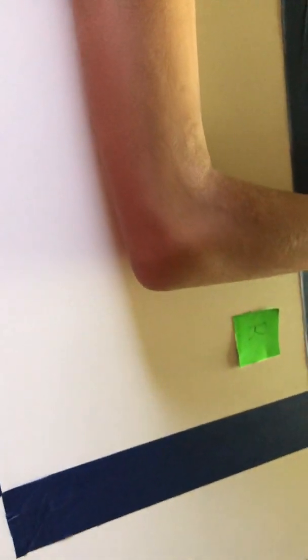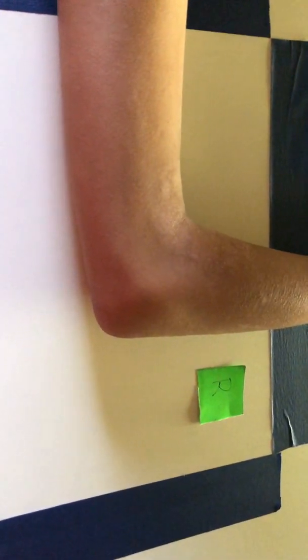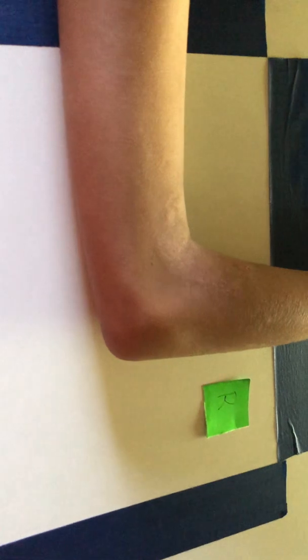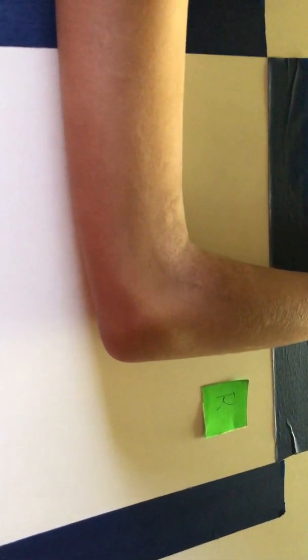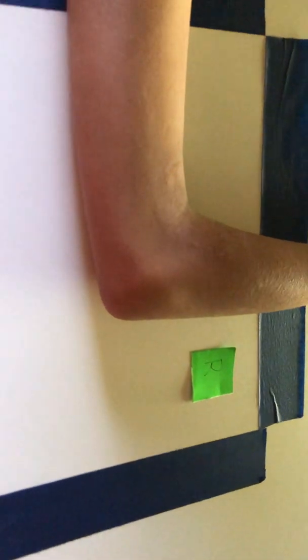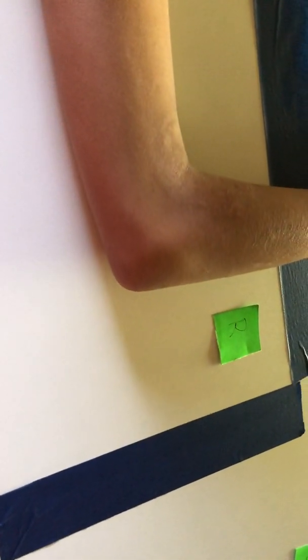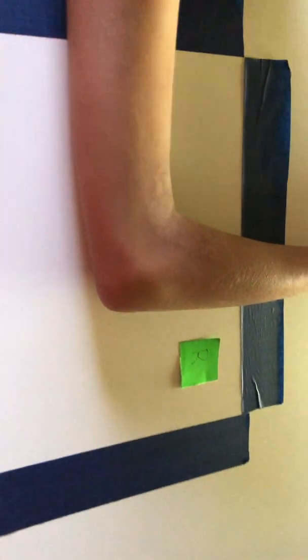For the lateral elbow, I will have the patient flex to 90 degrees, keeping my right marker right there, 10 by 12, 40 SID. The central ray is directed perpendicular to the midpoint of the elbow joint through the center of the film space. What we're looking for is the distal humerus, proximal forearm, and olecranon process, as well as the fat pads should be demonstrated.